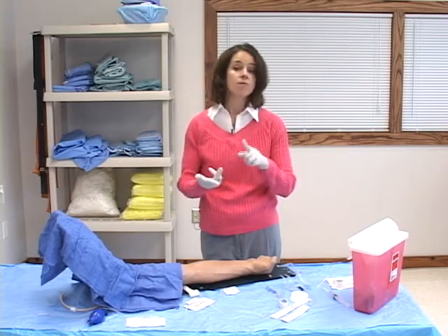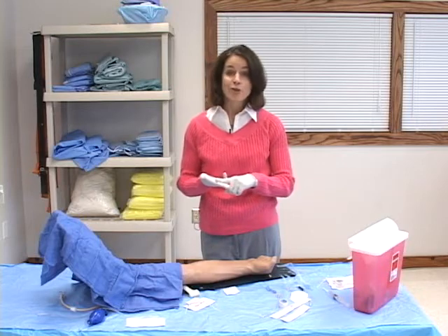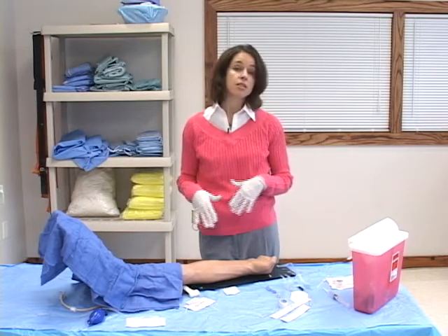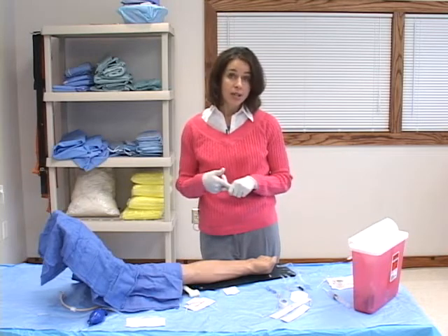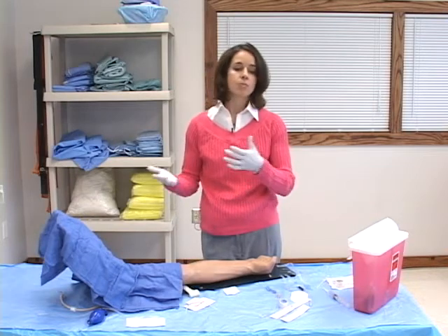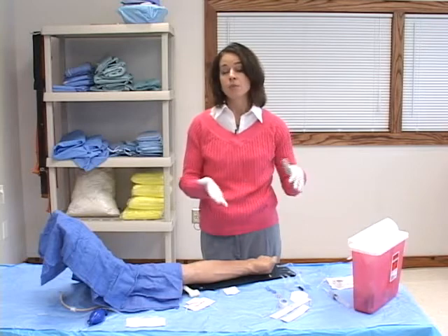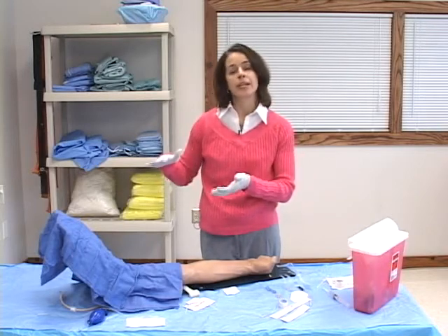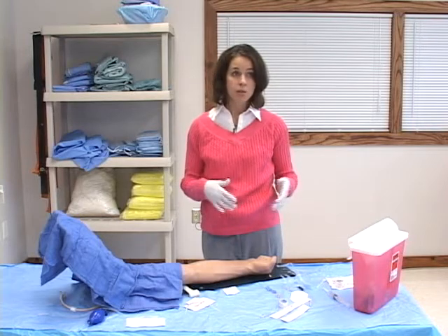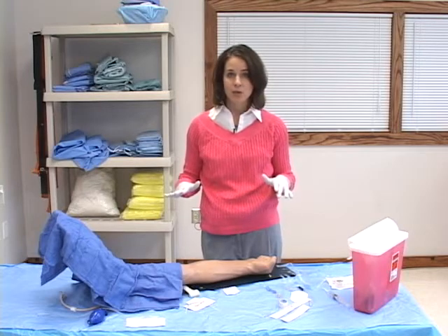So you have your parents involved, you may have your child life specialists involved, and you're going to have a few distraction techniques that you want to use. Once you have all that ready and you've discussed with the parents the importance of IV access and they agree to this procedure, preferably, if the child is going to be an inpatient, take them to a separate room, like a procedure room, because that allows them to keep their room in-house as a kind of safe haven. So take the child and the parents to the procedure room, and once you're there, you want to gather all the supplies that you're going to need in order to start an IV.